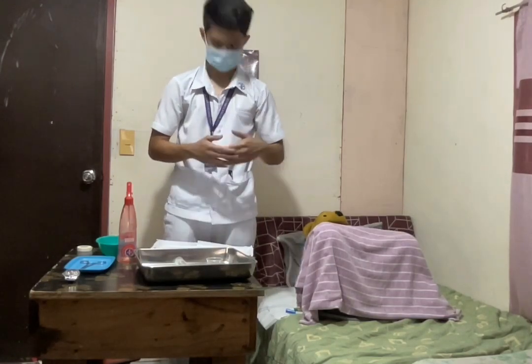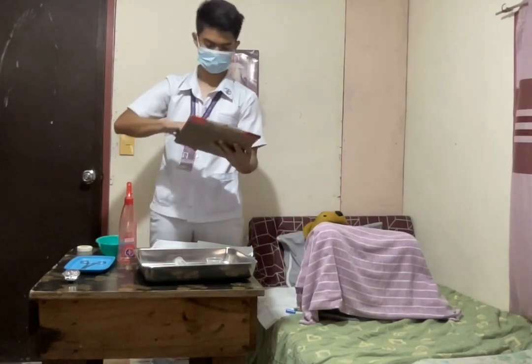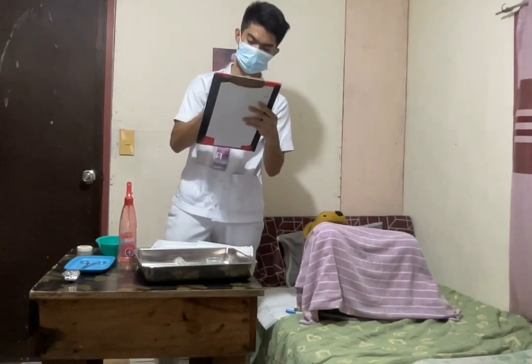Next, do the aftercare and record the time of the procedure, and the amount and color of the initial output. This completes the procedure, ensures patient comfort, and maintains accurate medical records.